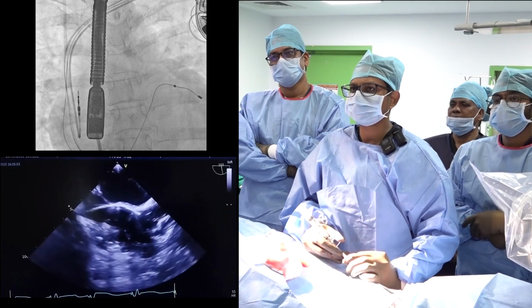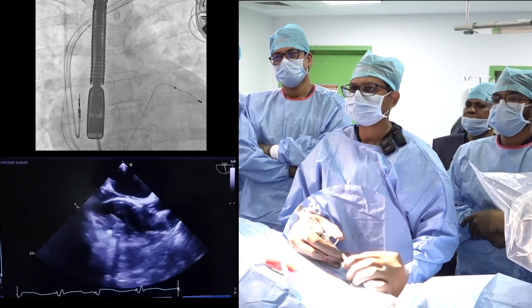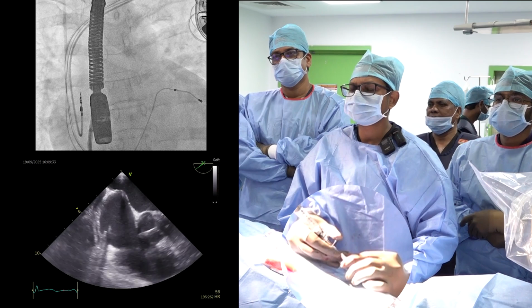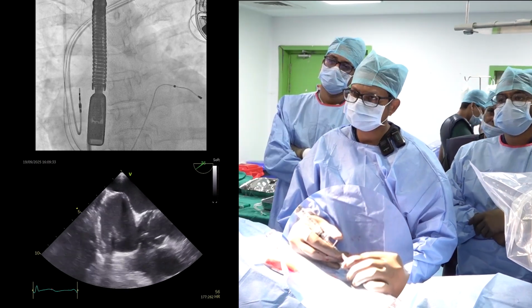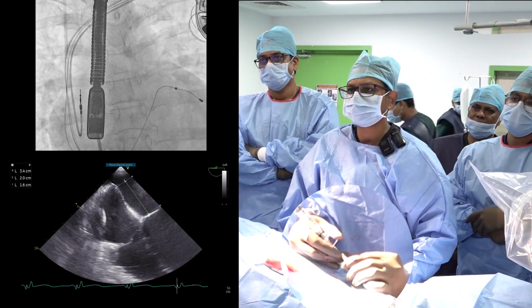Okay, I think it's good. A little bit more. Okay. I'll be at the ridge, that will be okay for me. Yes, this is good, sir. Can you measure the height? It's quite better, sir. 3.7. It's quite better. 3.8. Yeah, it's good. We can go, sir. Can you come to short axis? Yes.